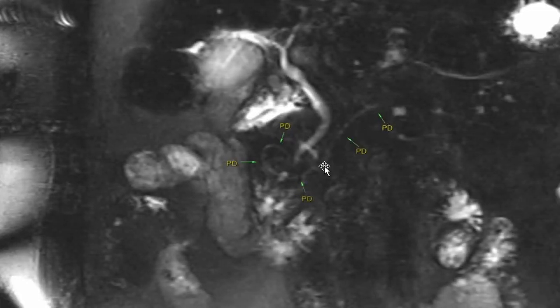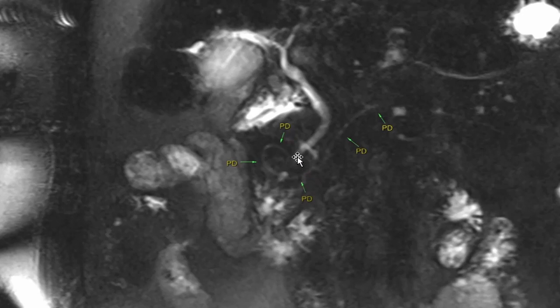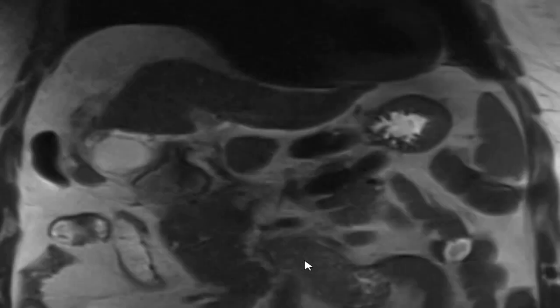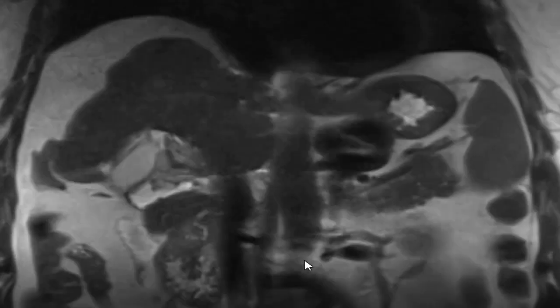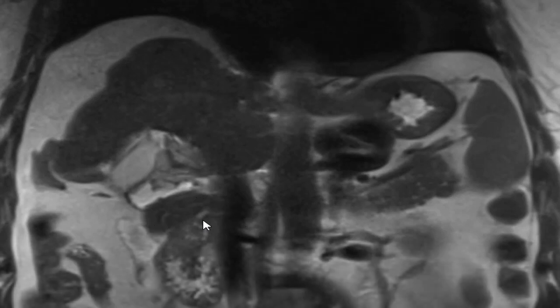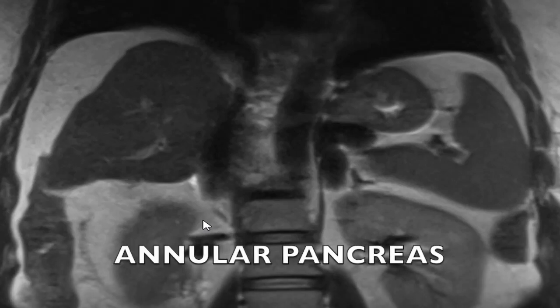This MRCP image in a patient with chronic liver disease shows the main pancreatic duct forming a wide loop joining the terminal CBD to form the confluence. The first and third parts of the duodenum can be appreciated with fluid contents within, however the second part of the duodenum is not well visualized. Coronal T2-weighted images of the same patient show the pancreatic parenchyma completely encasing the second part of the duodenum, with no obvious proximal dilatation or obstruction. These findings are consistent with complete annular pancreas.